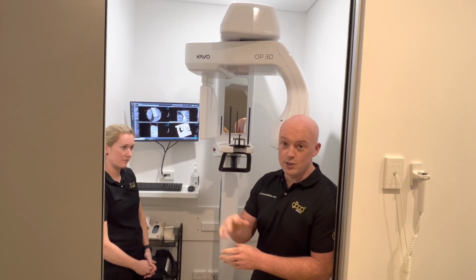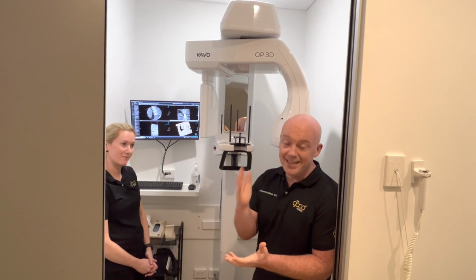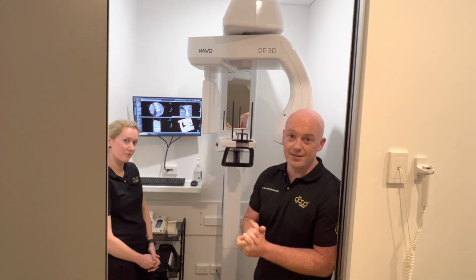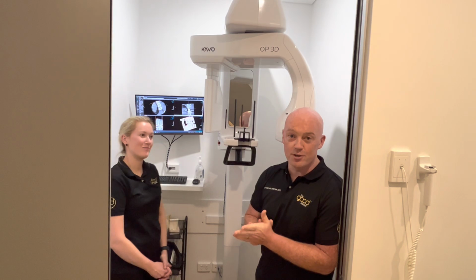Had a real close look on the CBCT. It appears that the actual root is right into the lingual bone. Saved your bacon. Saved my bacon. Off the patient goes to one of the local surgeons.